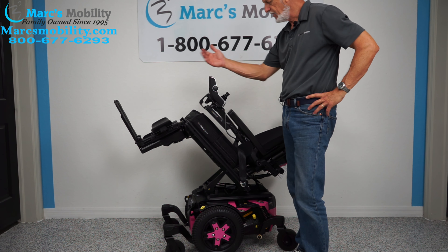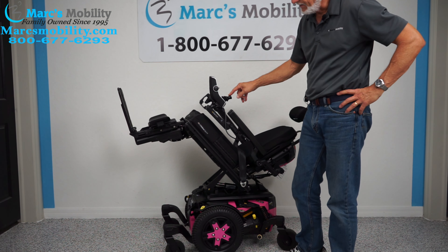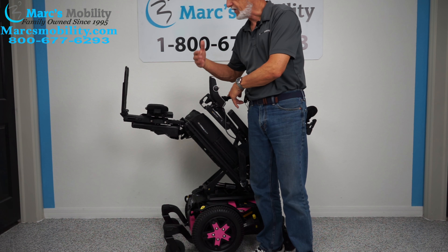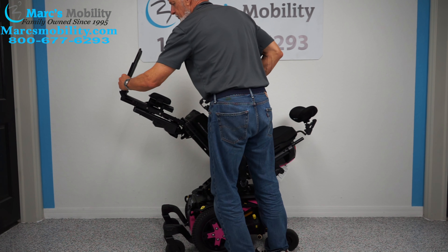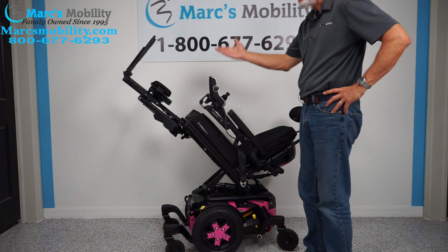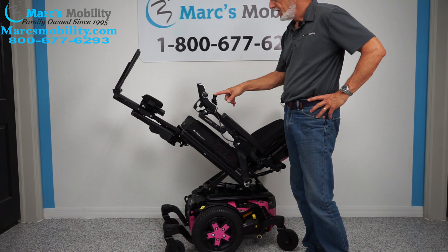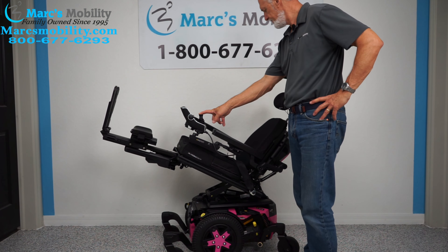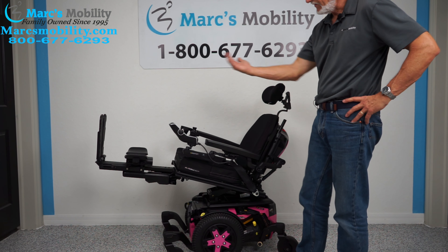The next function I'm going to show you is the legs. If you needed some circulation, I want to show you how high the feet go. Also, if you're five feet tall or six feet tall, we can lengthen these legs. There are two screws right here — we can move these foot plates in and out depending on how tall you are. If you only go halfway, you can still get good circulation with your legs higher than your body.